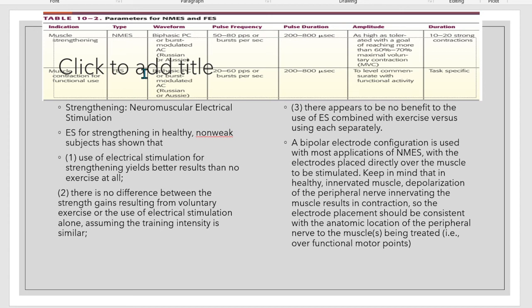So, here, strengthening, makita na ni sa NMES. Again, to emphasize anang word nga strengthening, that is only for kung grade 1 or grade 2 na ang imuhang muscle. So, di ba? Dili ka mo-apply og NMES kung zero pa siya.